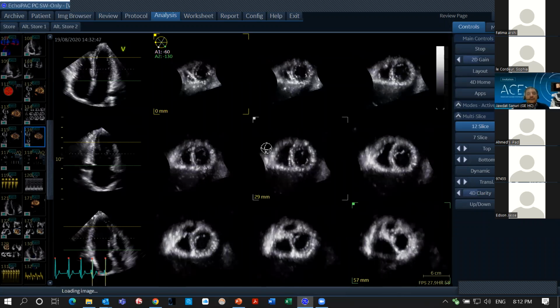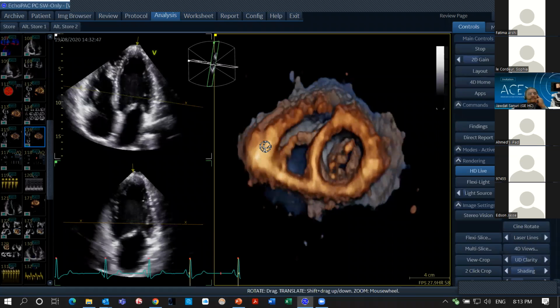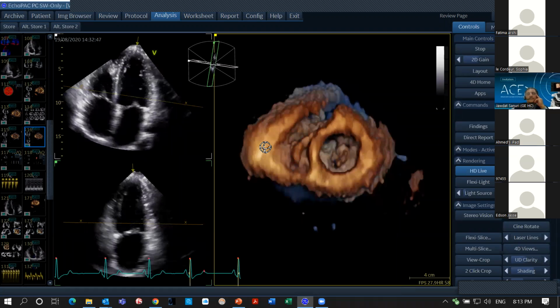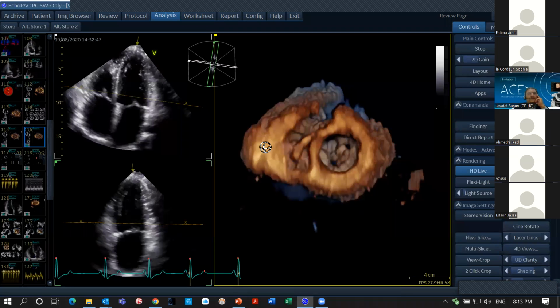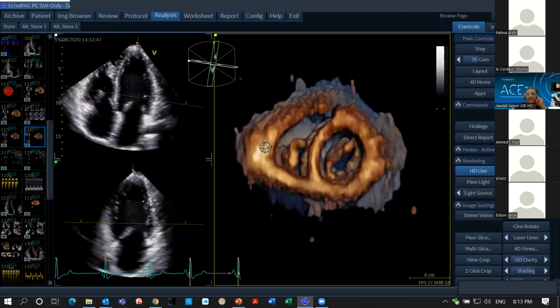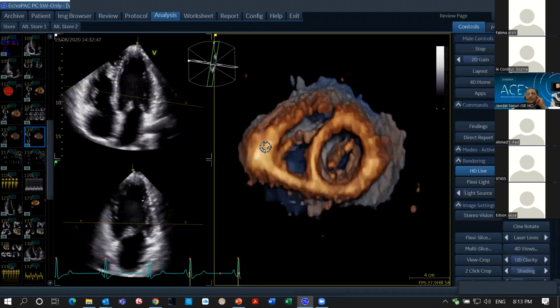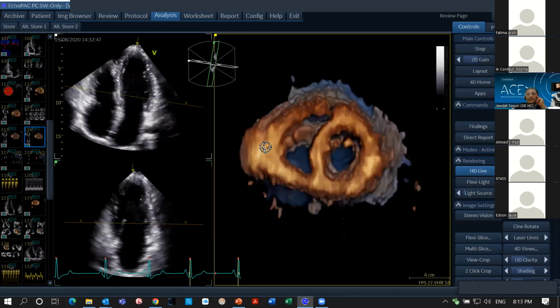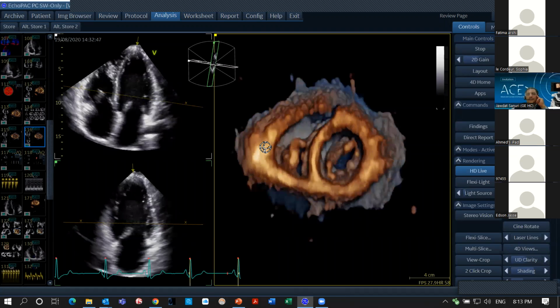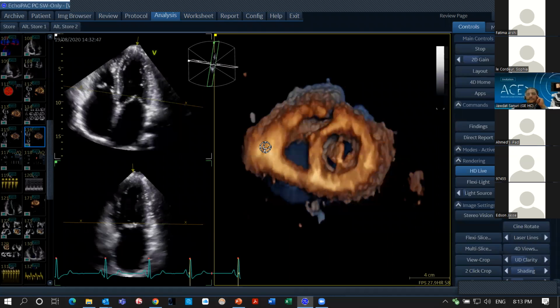No, it's because the image store is not highlighted. That's why I just use the P2. The P2, this is the whole scan. It will be the acquire. It is not going for the live session. I'm sorry, I'm not sure I'm following. What do you mean by P2? P2 is the other option for the image store. Whenever we are not able to store the images with the image store, this button is not highlighted, so we are just using the P2.